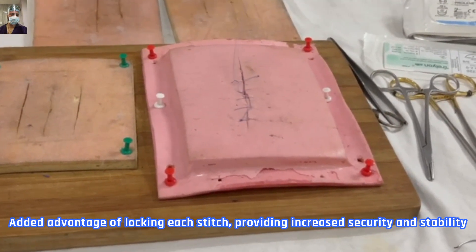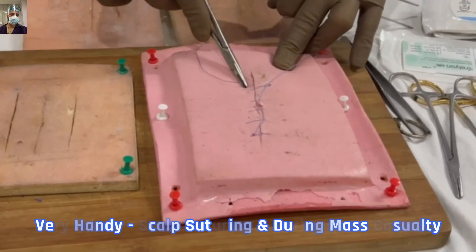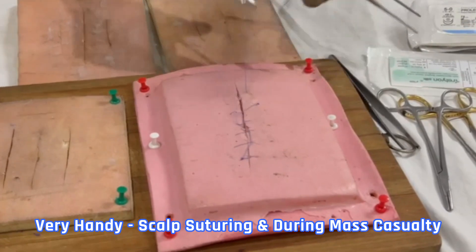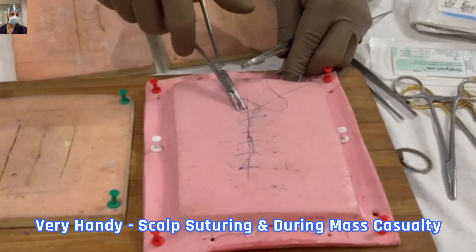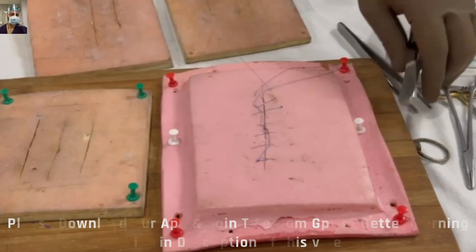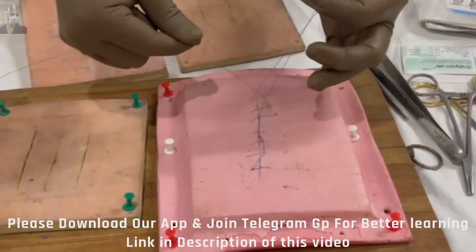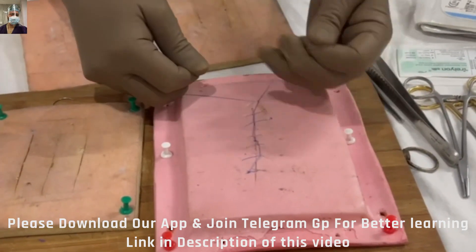For the sake of demonstration, I am taking bites from both sides of the incision at the same time, but that is not recommended. You have to practice taking one side at a time, then come out on the other side — just don't follow that shortcut.